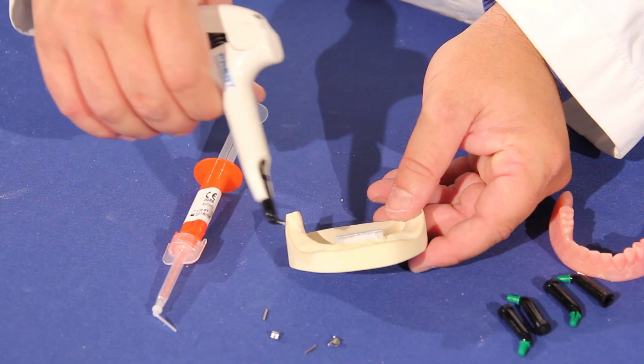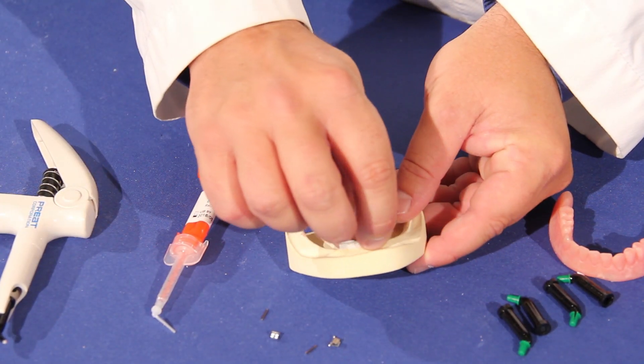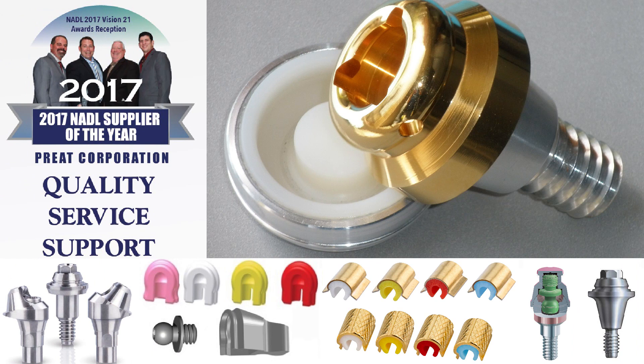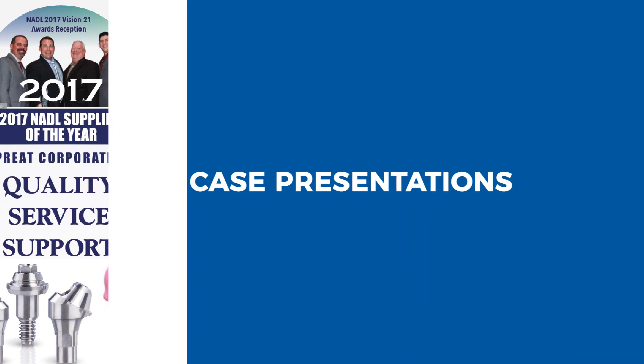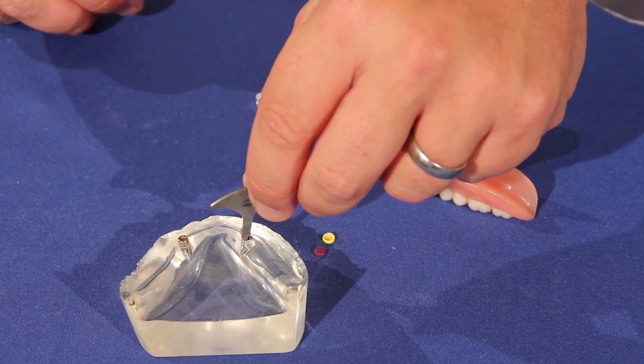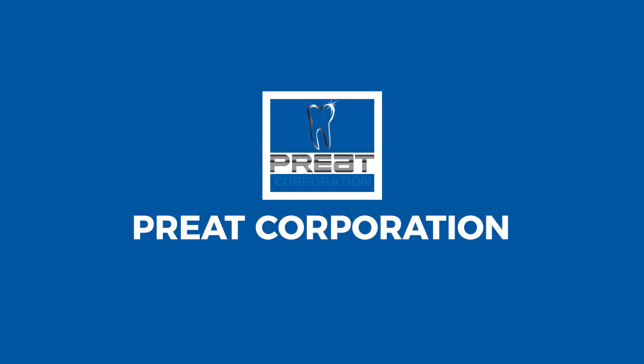In this video, we're going to talk about O-rings in dental implants and attachments, and in particular, different O-ring sizes. One of the challenges of dental implants and attachments is figuring out what size O-ring you need.